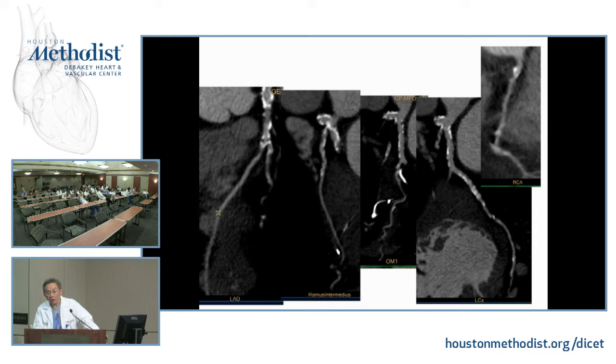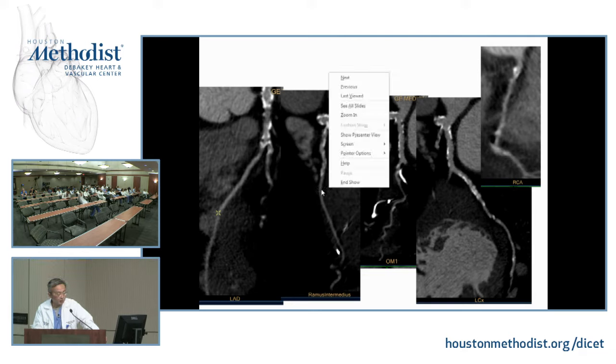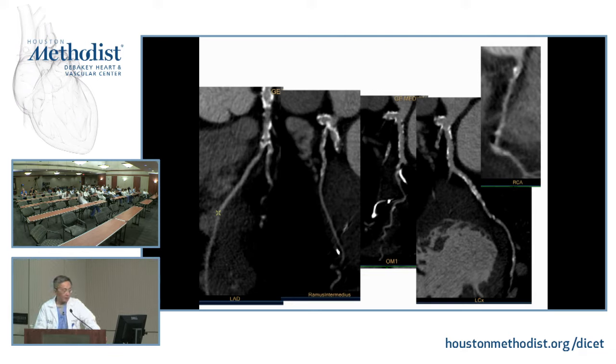But the point I want to get to is, you could argue this patient has symptoms, and the stress test is equivocal. But from a management standpoint, I think it's useful because the guy is 95, not very symptomatic, doesn't have left main disease.